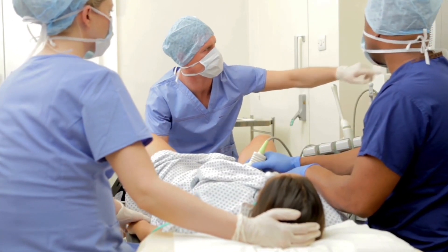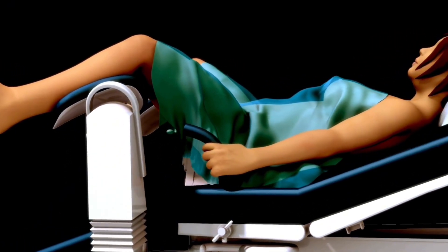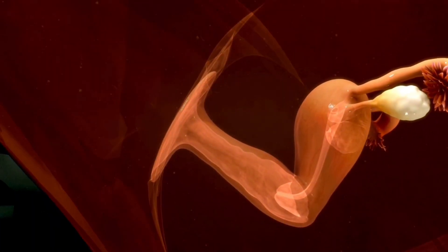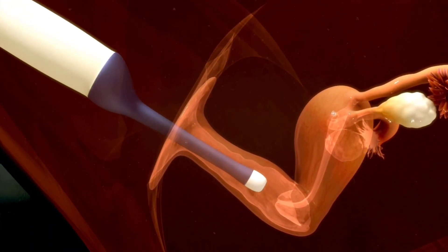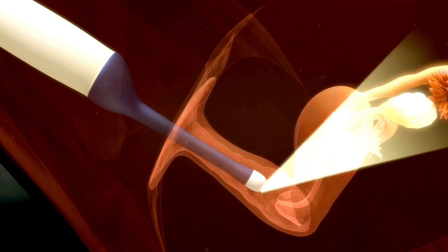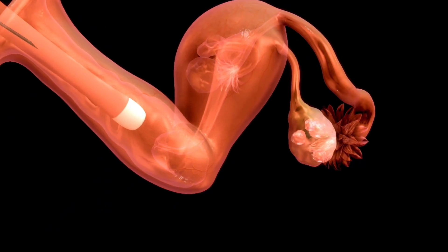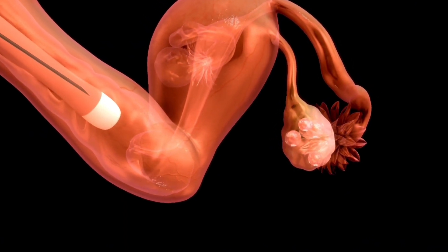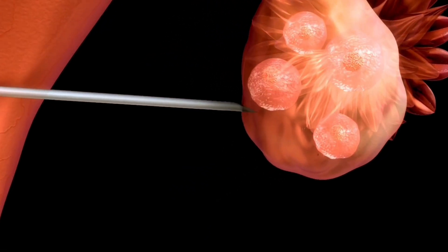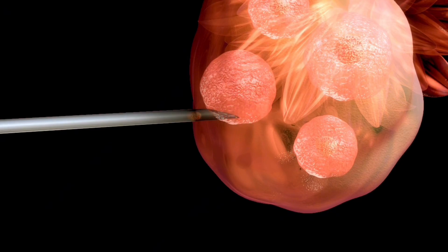During the next step, called follicle aspiration, eggs will be harvested from the ovaries. An ultrasound probe will be inserted into the woman's vagina so that her doctor can view her ovaries and look for follicles. Each follicle is a fluid-filled sac that contains an egg. Then the doctor will insert a long, thin needle into and through the wall of her vagina and guide it to the ovary. A suction device connected to the needle will collect several eggs from inside their follicles.